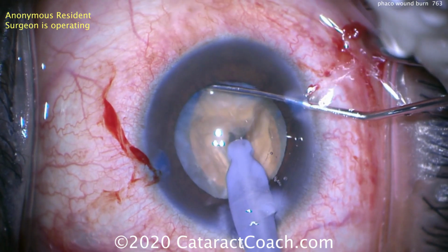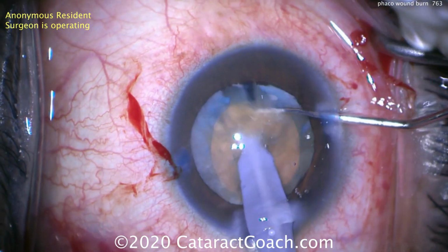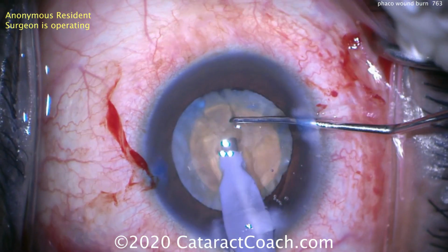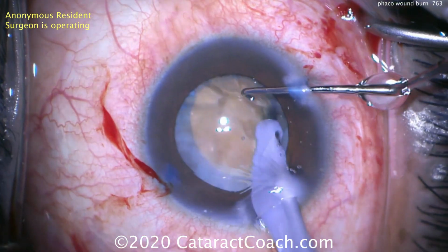So phacochop is going to be performed here, buzzing into the nucleus with the chopper and the phaco probe, trying to split it. There's a little bit of a crack. I like that. But what should you be looking at when you're critiquing this video?